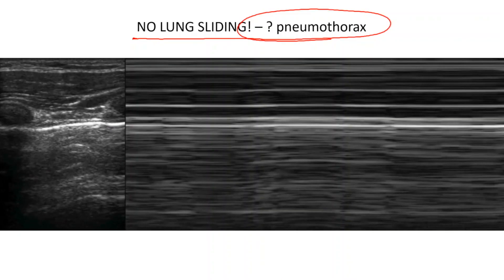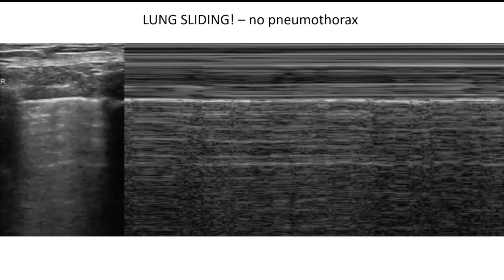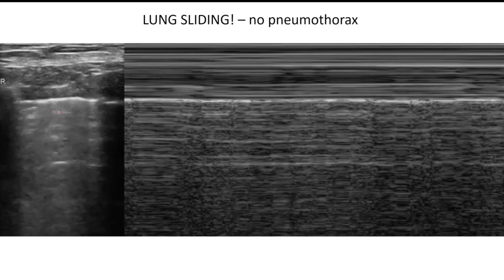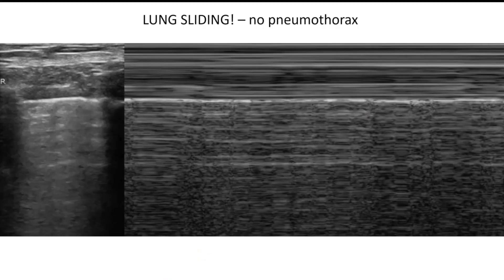Let's go back and look at what lung sliding looks like again for comparison. This is lung sliding — see the difference? Things are clearly sliding there. The important thing to do practically is to get an ultrasound transducer when you're seeing patients, put it on them, and see if you can detect lung sliding. If you do it more and more, you'll learn what normal looks like.